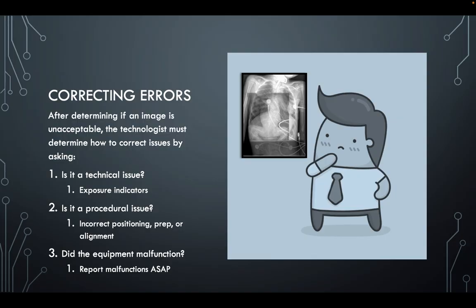If you get a patient in position and you take an x-ray and you didn't instruct them to hold still until you told them otherwise, maybe they hear the beep and then they start moving. And then you look at your x-ray and you notice that there's a rotation issue. If your patient just moved, it is so difficult to get them back into the exact position that you just had them in, to then be able to make the correction that you need to make.